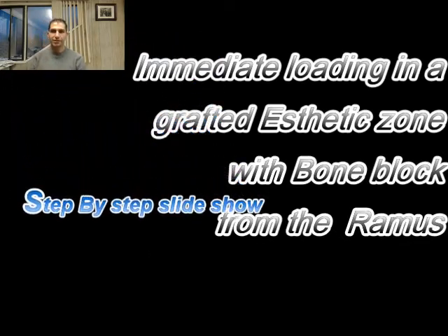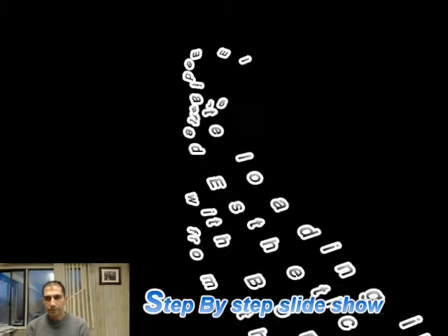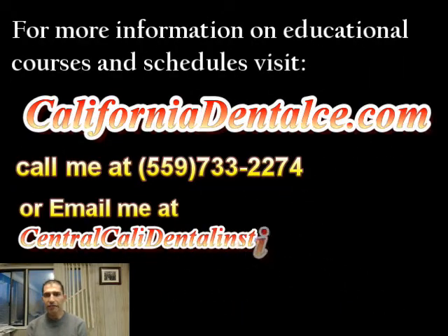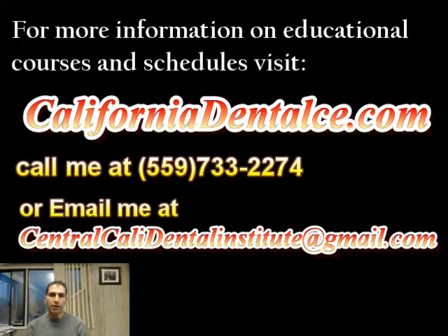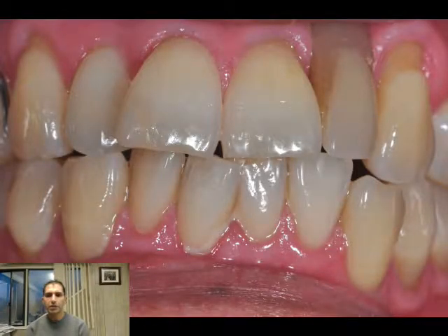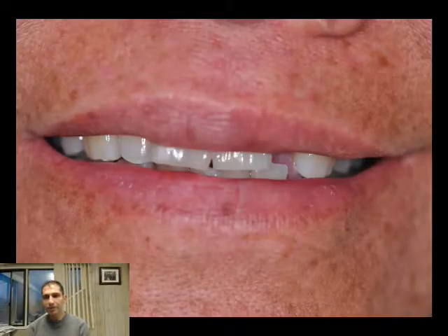Hello, this is Ferris. This is one of my patients and I'd like to share with you what we have done here. The patient is a healthy 56-year-old female with a missing upper left lateral incisor.